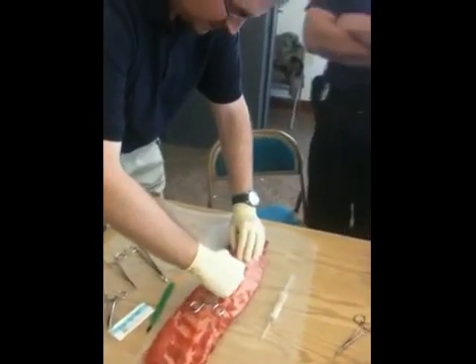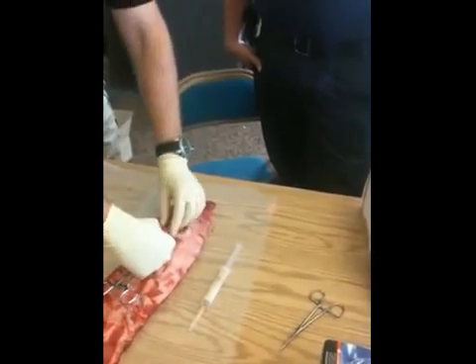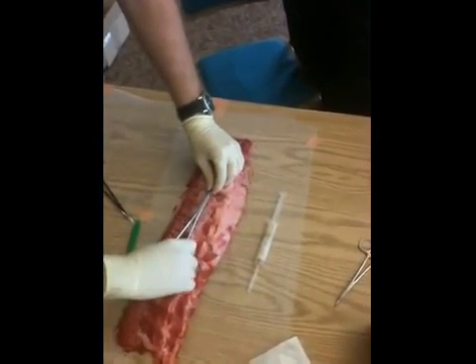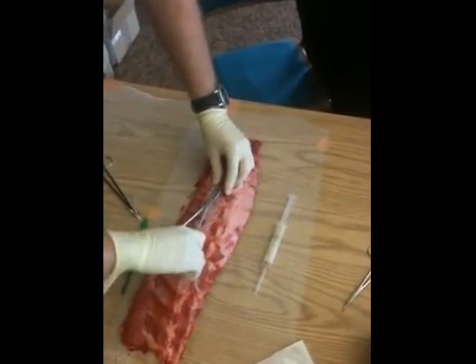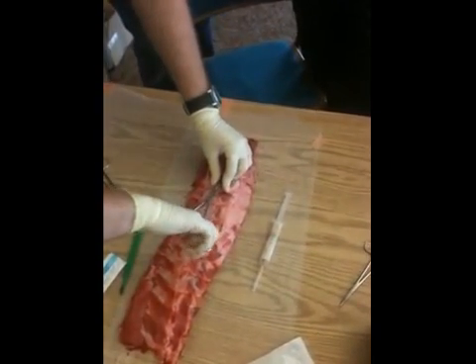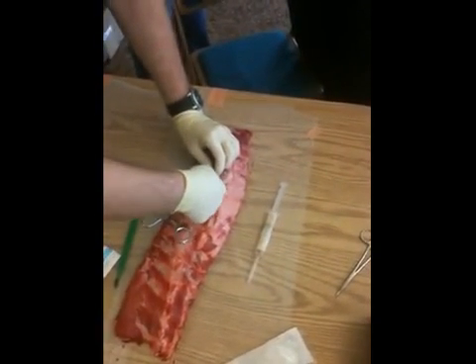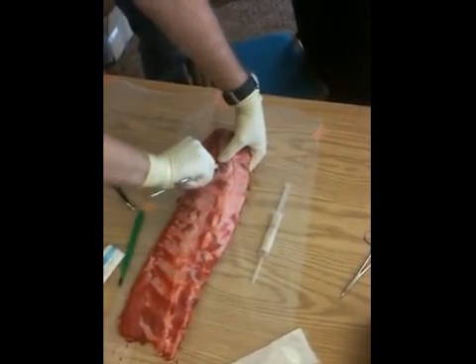You're going to be talking to your patient, because now they're going to be feeling lots of pressure. I don't care how much you've anesthetized this — they're going to have pressure. As I go in, I'm going to perform blunt dissection of the tissue, going over the top of the rib and avoiding the bottom of the rib. I'll get a little bit of resistance there — that's the pleura. We're going to feel a lot of pressure and pain here; I apologize. You're going to pop through the pleura, and you'll feel it pop.